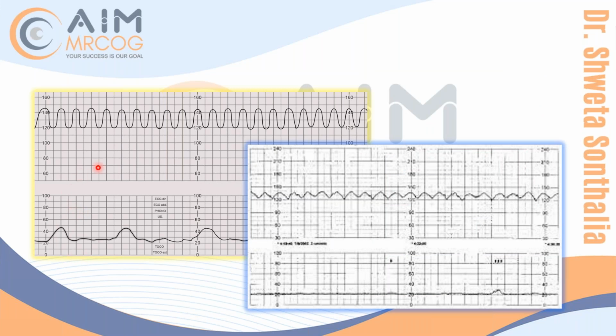Now, this is the sinusoidal pattern. Okay, my dear, thank you. So this is the sinusoidal pattern, which they say is a sine wave pattern. Sine wave pattern means it's undulating, like the wave we draw. So this is what sinusoidal pattern is.